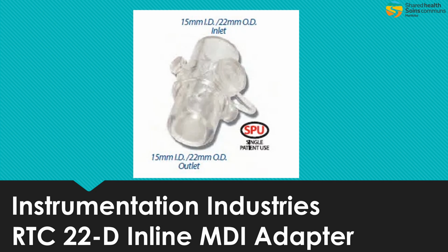The nice benefit of this device as well is that if your patient is currently in cardiac arrest, whether we have an iGel in or not, and we believe they are in cardiac arrest due to severe bronchospasm, we can now give salbutamol during that arrest.